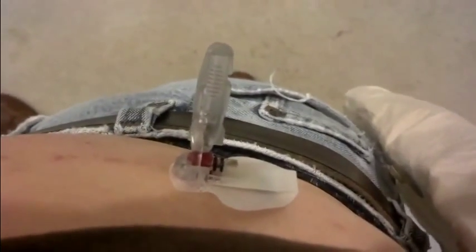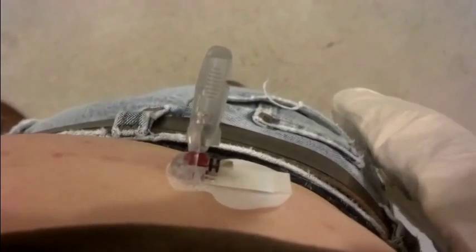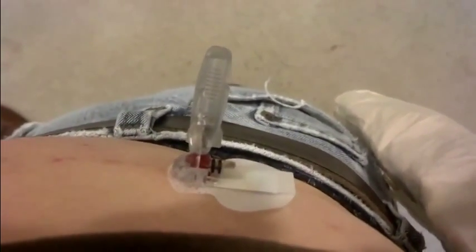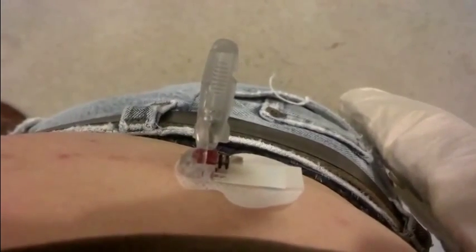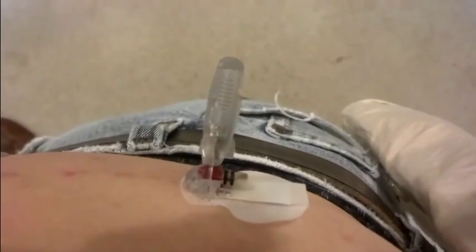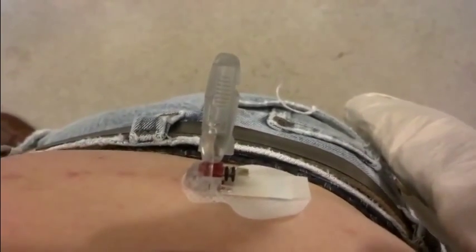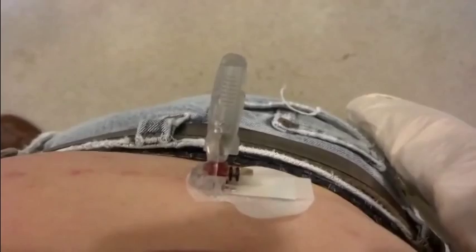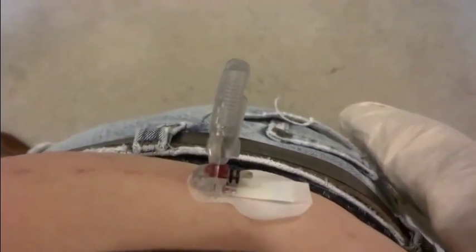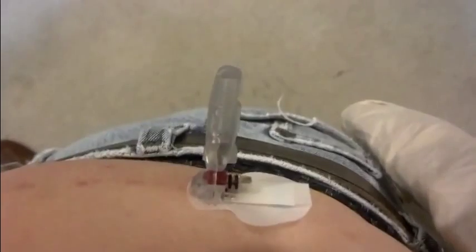What's supposed to happen is this device goes in using the inserter device. You put your fingers on the base of it with one hand, and with the other hand you remove the part that's protruding from the abdomen — the part that's sticking perpendicular to my skin. However, three, four, maybe five times now, I've had problems.